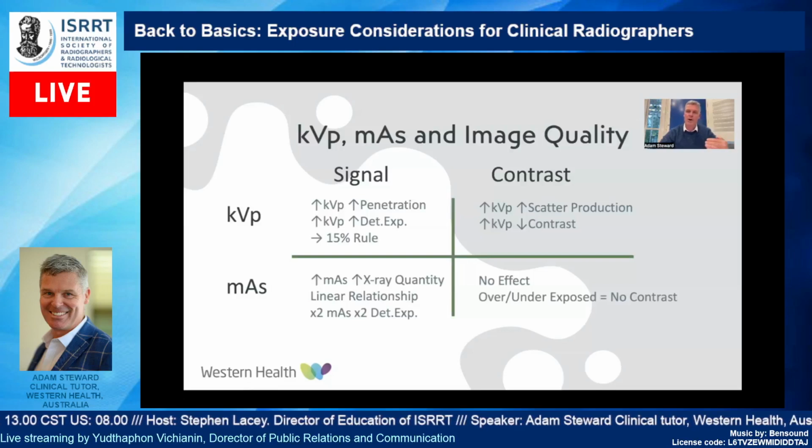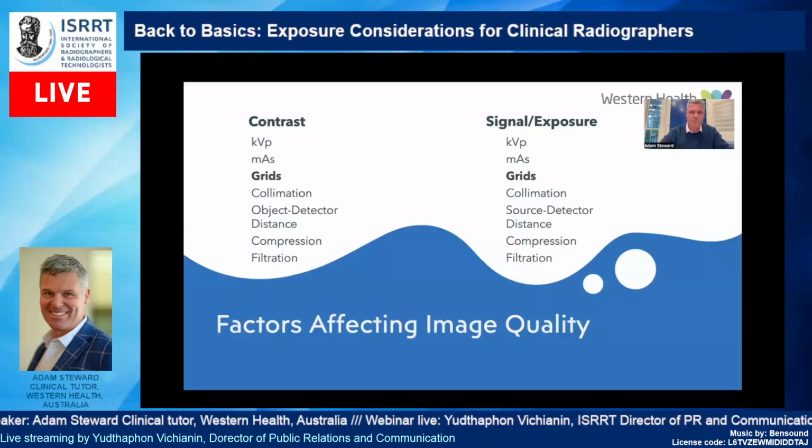And once we've got an adequately exposed image, then the mAs really won't control the contrast to any great degree. And that's really important, because it means you need to be very vigilant, very careful by watching where your exposure is sitting within the limits of what your system allows.